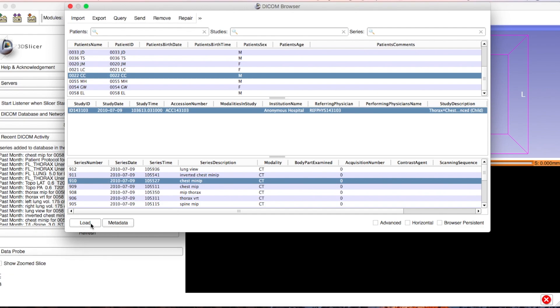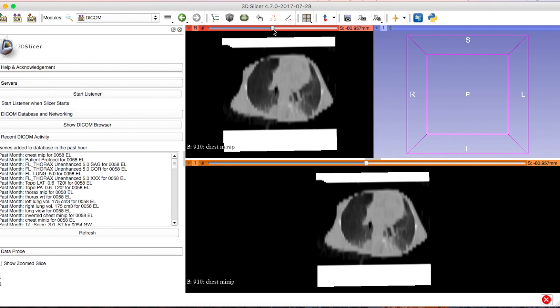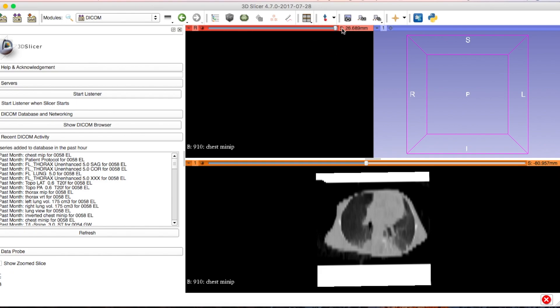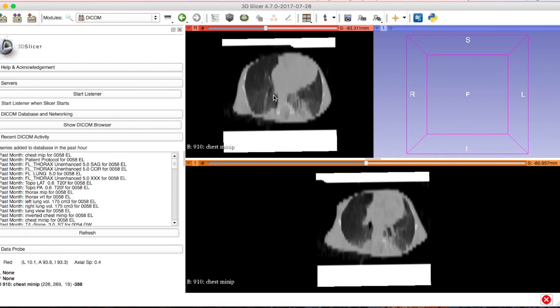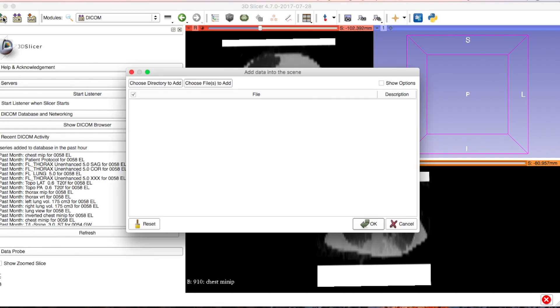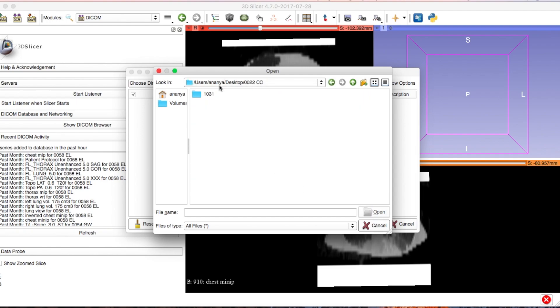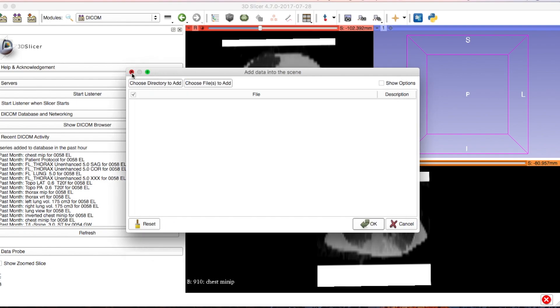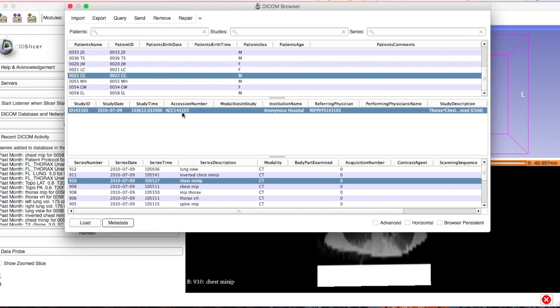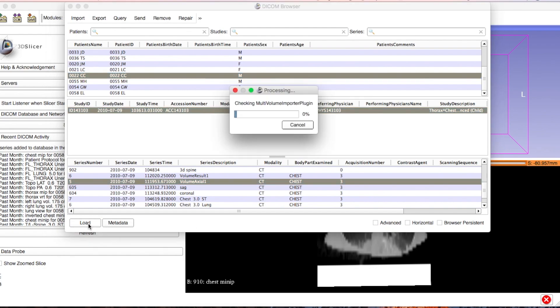Usually the first three and the last three are bad. I'll show you what a bad scan looks like — it's extremely fuzzy and you can't tell what's what. Click 'New' when you want to upload a new file. Don't go back to Data and choose new files because it'll take you to a folder of individual scans. Always go to DICOM the very first time, before you've cleaned up the scan.